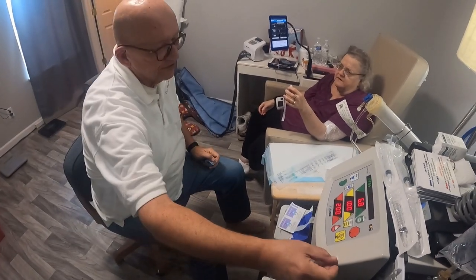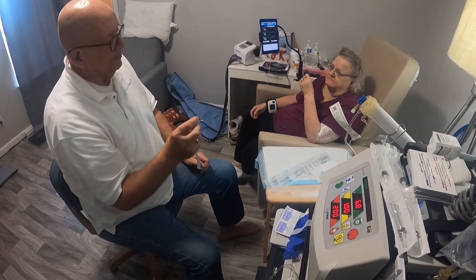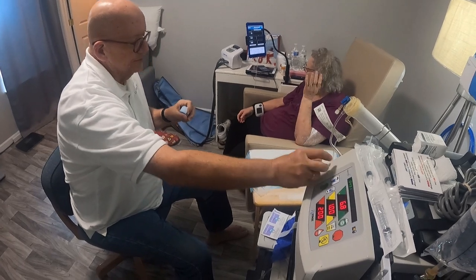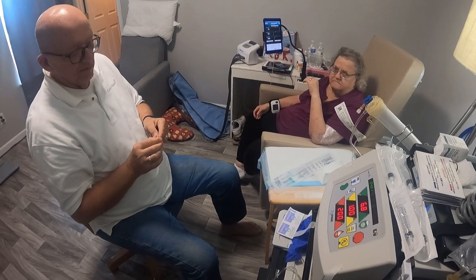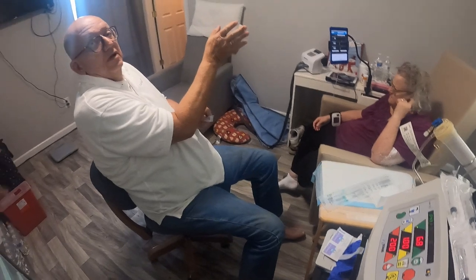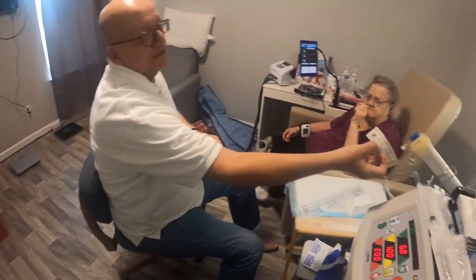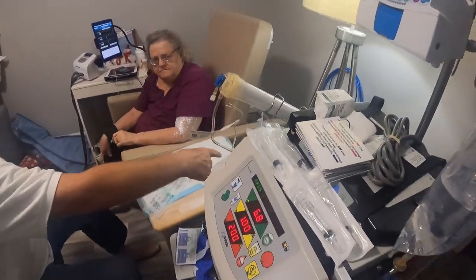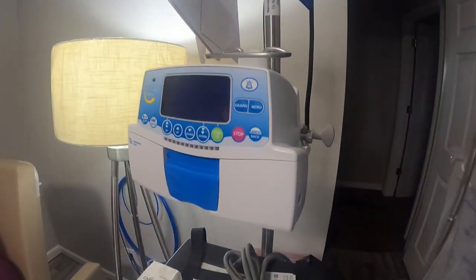Instead of hitting those check boxes like they want you to do, I put a note at the bottom that says half of these need to be 172 because we're infusing 3 days a week. Can they make them like that? Yes. If you go in the closet right there, look to your right, there's a set of boxes that say 170 on them, and another set of boxes that say 172. The 172 has an extra line that you use to plug the infusion pump in with.